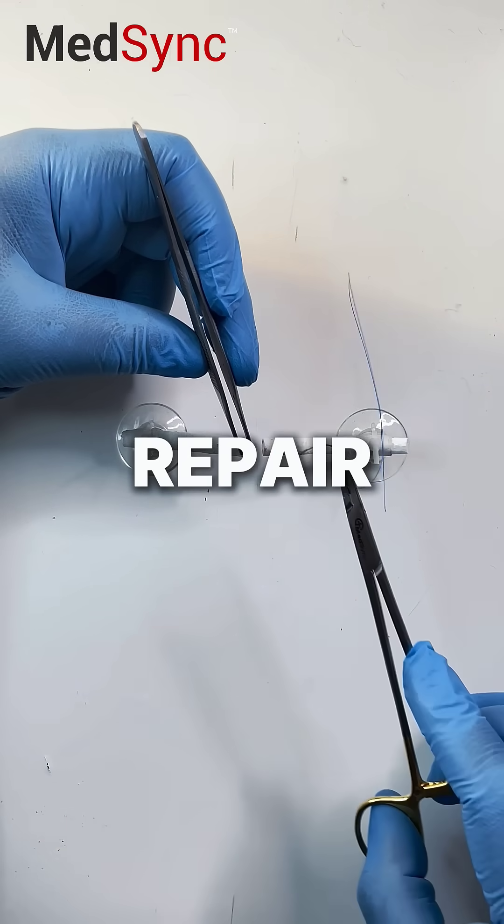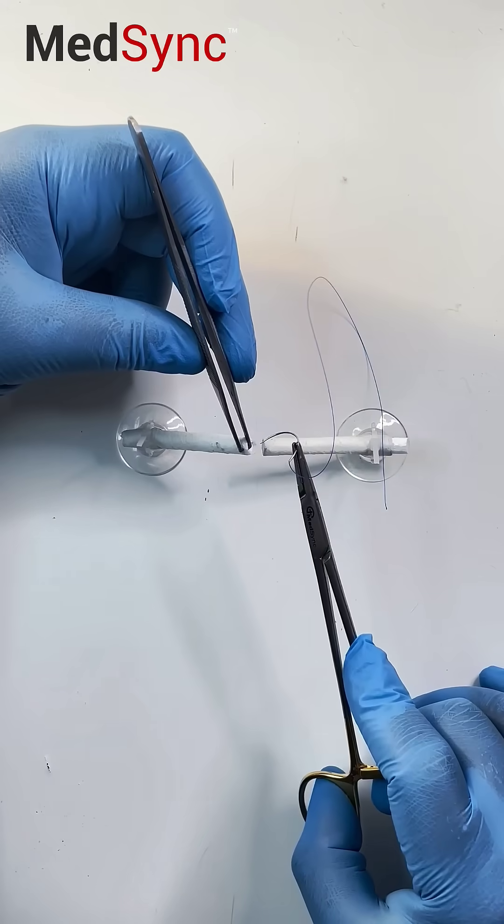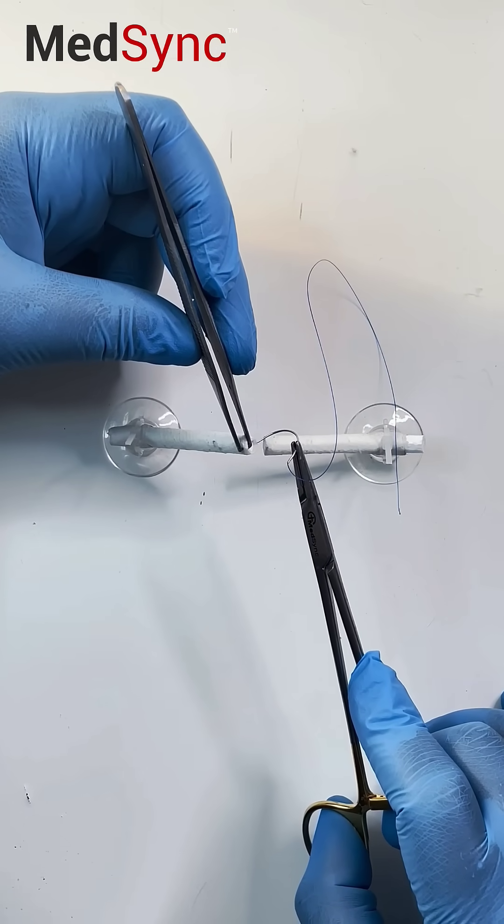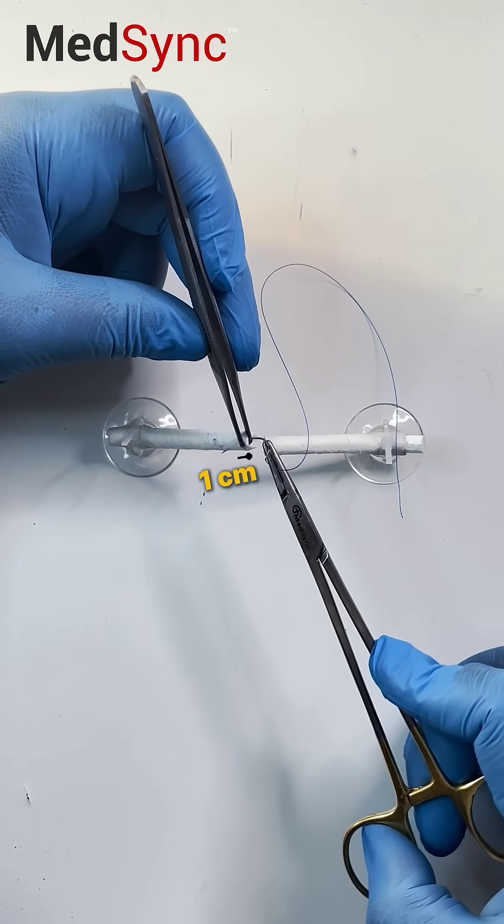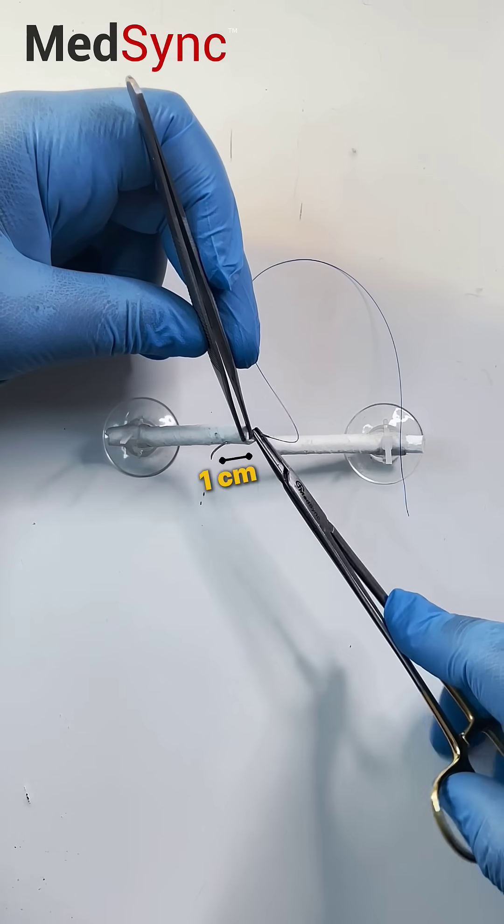The cruciate tendon repair is a favorite for many. You start in the middle so that your knot remains buried. Go one centimeter obliquely across the tendon.